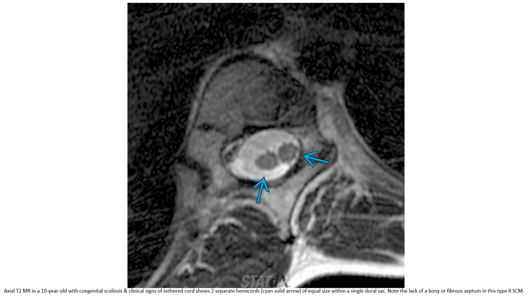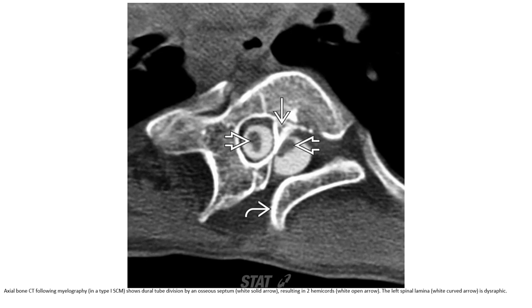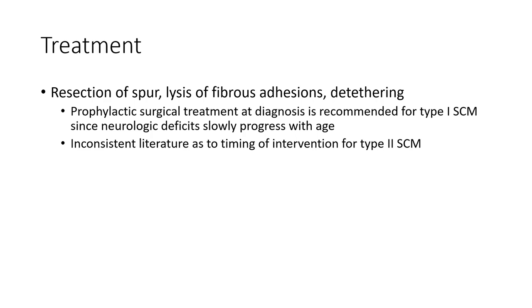The third case is a 10-year-old with SCM at the level of the mid-lumbar spine.